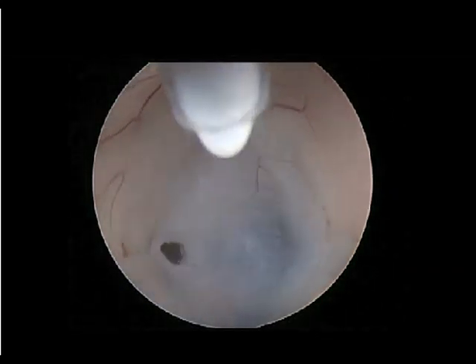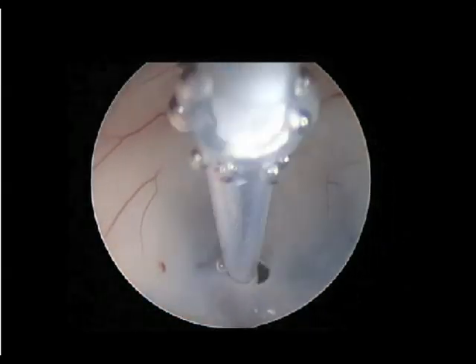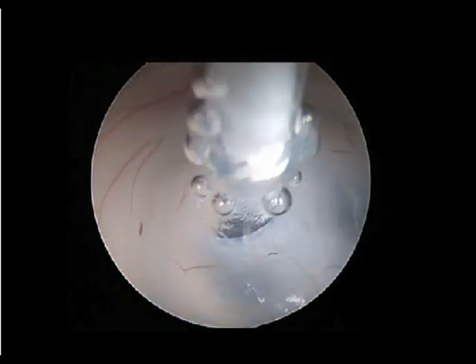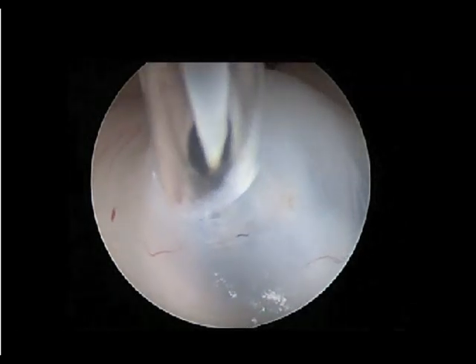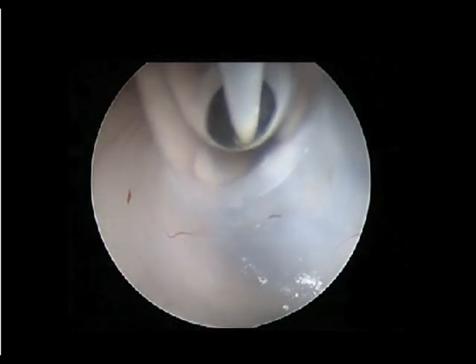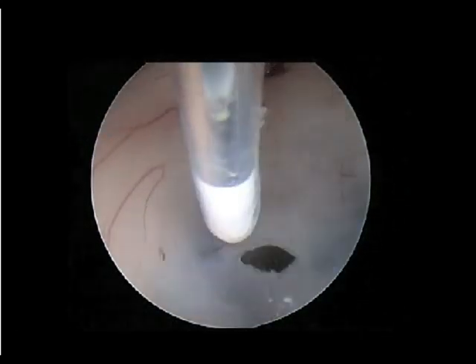Once the perforation is made, we pass a 3 French Fogarty catheter into the prepontine cistern. In order to enlarge the opening, the balloon is opened within the stoma and pulled through. Notice that the balloon is not being inflated completely to avoid hypothalamic injury and causing undesired bleeding.